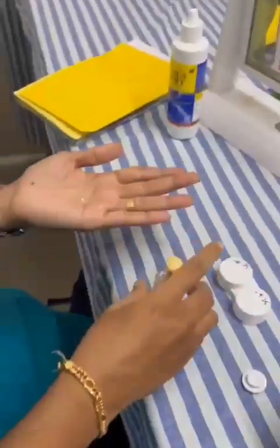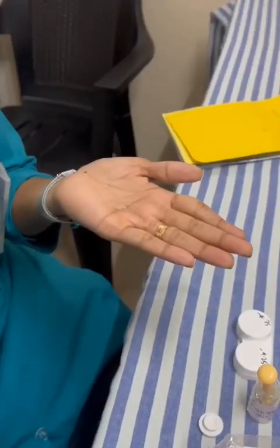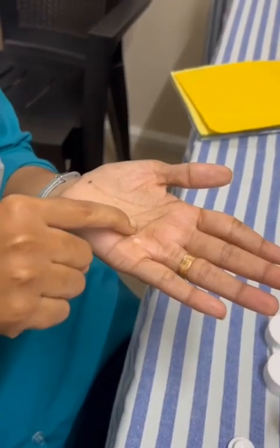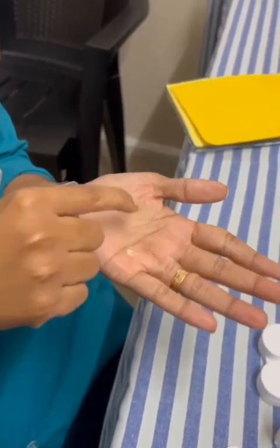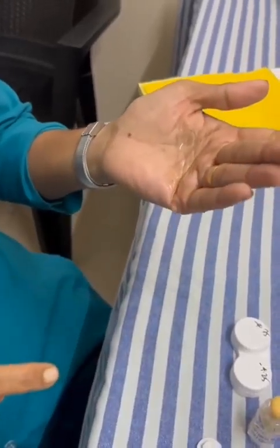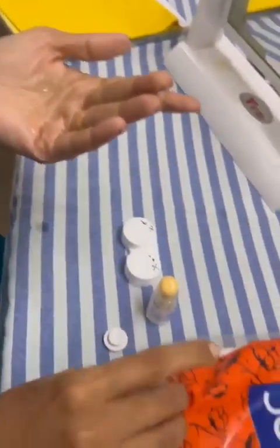Another important step is lens cleaning. We should properly clean the lens with a contact lens solution, and the excess solution can be washed off with a tissue paper.